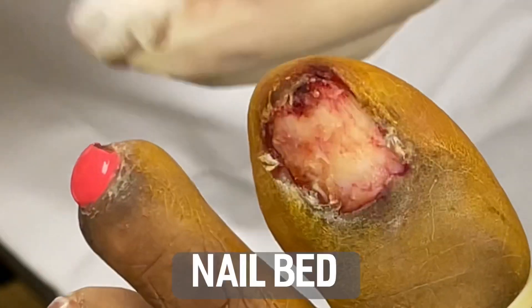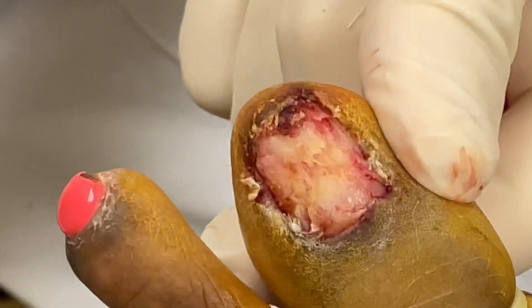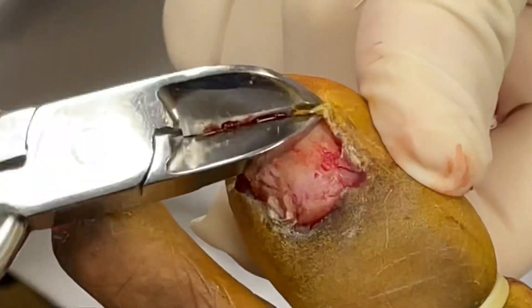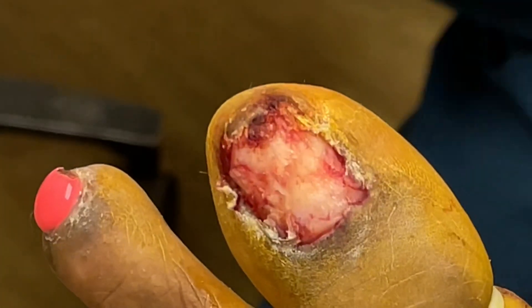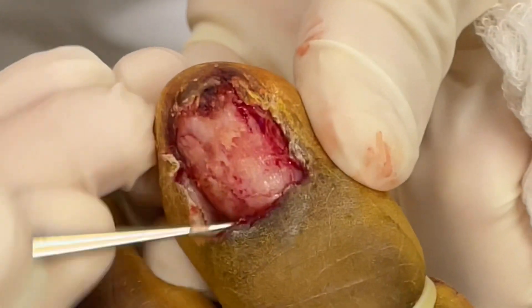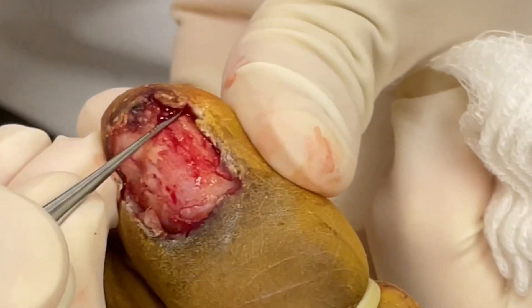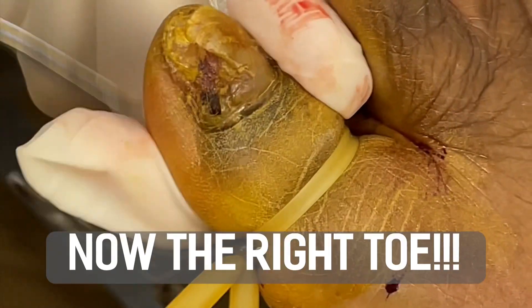The nail bed under it becomes kind of calloused and what we call hypertrophic, so we have to remove this infected and inflamed skin. It's not infected from a bacterial standpoint — it's more of an inflammatory response to the skin. We also check under the eponychium, which most people refer to as the cuticle area, to make sure there's no debris or fragments.